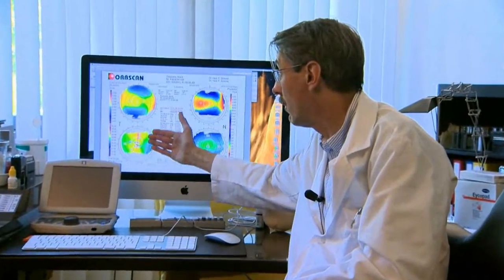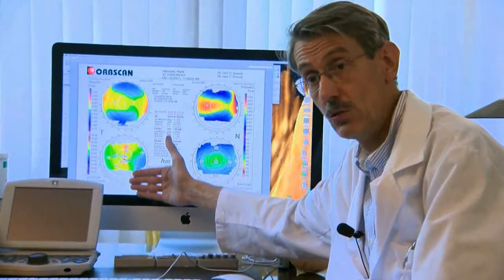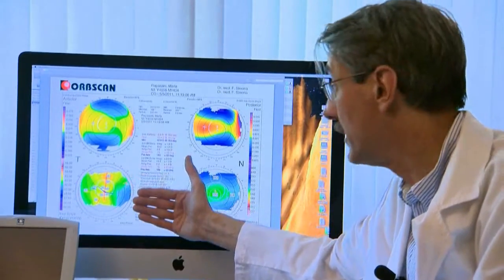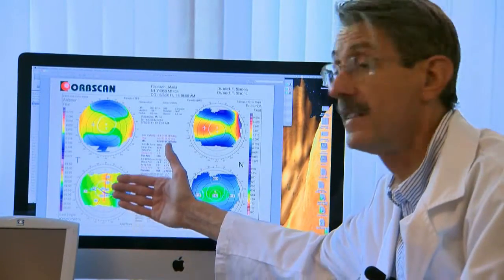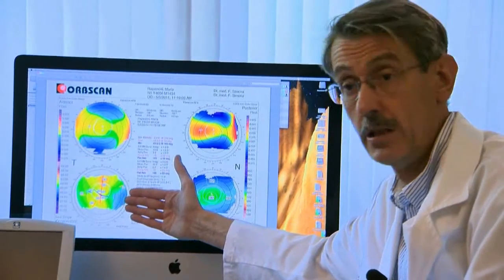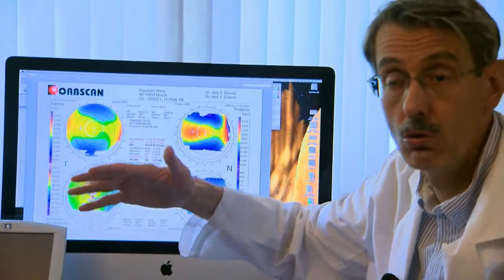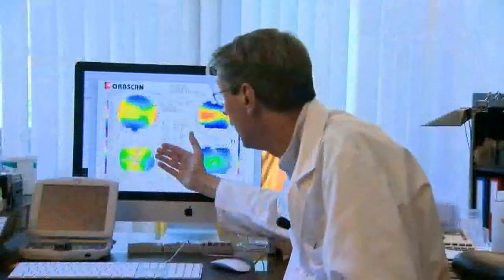In addition to this, by using corneal topography, you can get a full and accurate image of the astigmatism. Not only a precise definition of the axis, but also its degree of regularity. In other words, you can determine whether you're facing regular congenital astigmatism or else, for example, if there's a large bulge here, whether a keratoconus is developing. Corneal topography really gives you further useful guidance in deciding on the treatment and defining which toric lens to implant.